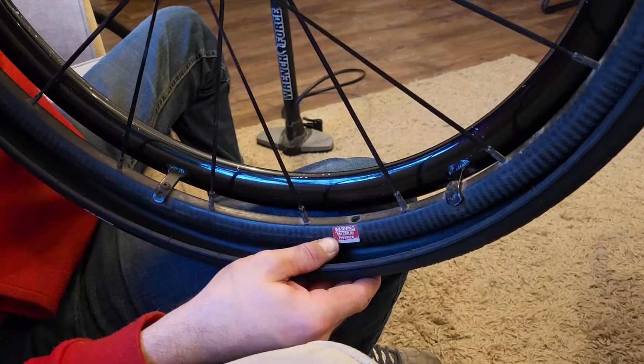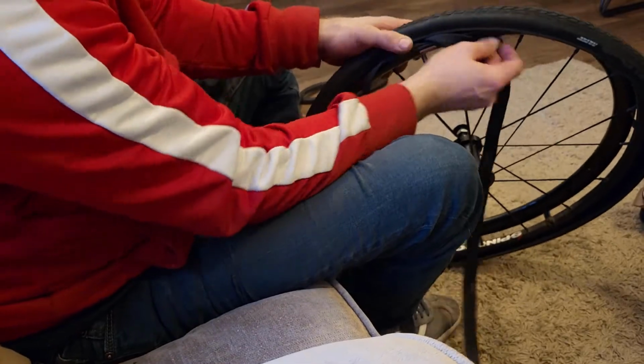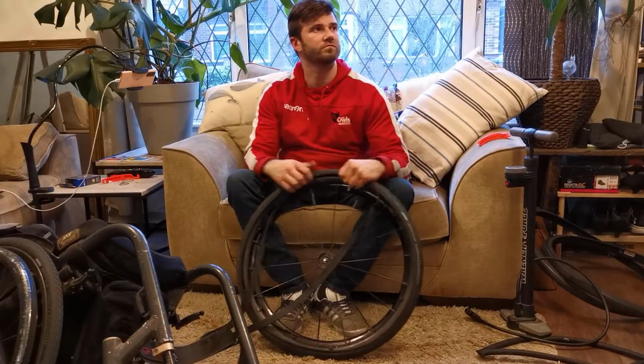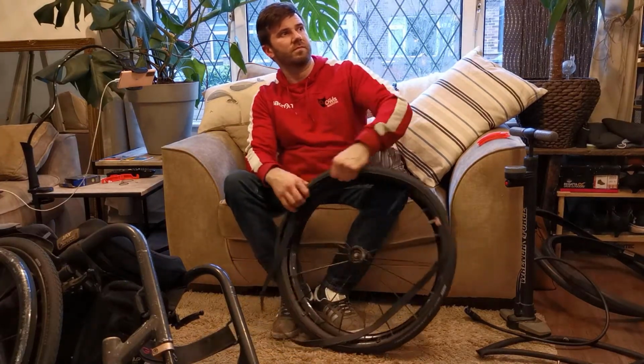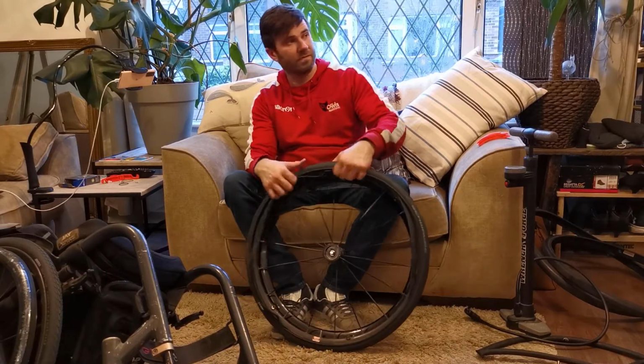So if it does, just a bit of insulation tape will stop that from happening. Making sure the tyre is pointing in the right direction, getting it back onto the rim. I'm then going to insert the new inner tube, just put the valve through the designated hole and then slip the inner tube into the inside of the tyre.